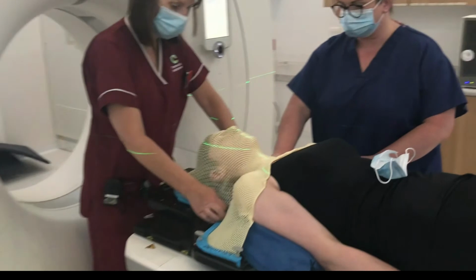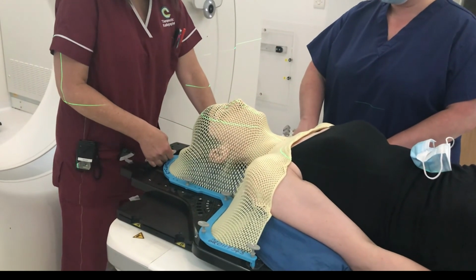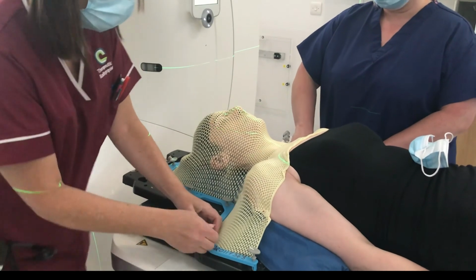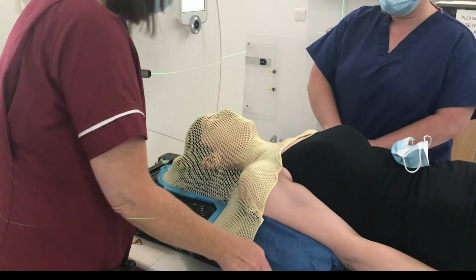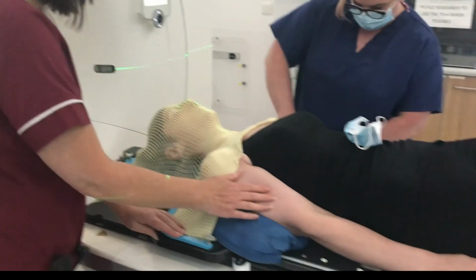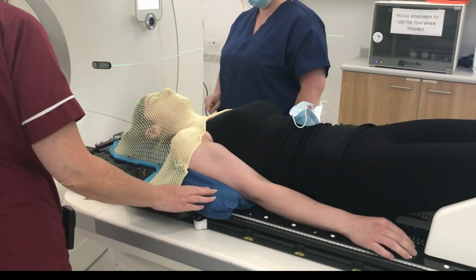Sometimes patients will need additional scans like MRIs or a PET CT in order to make sure the radiotherapy treatment is planned as accurately as possible. The mask will be worn for this scan also and will often be done on the same day as the mask production and planning CT.